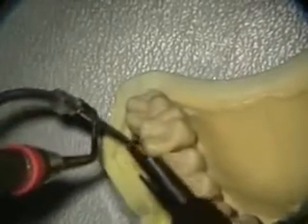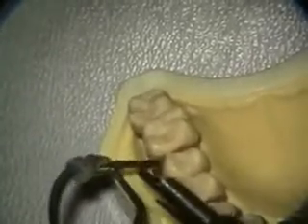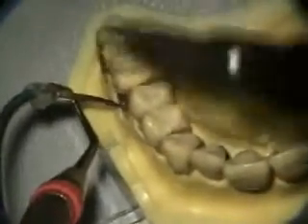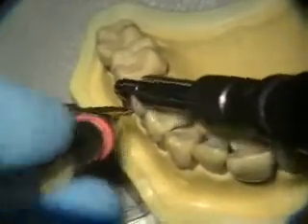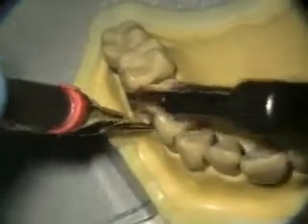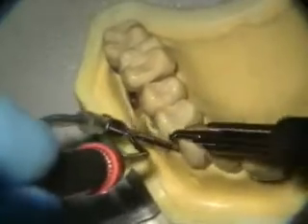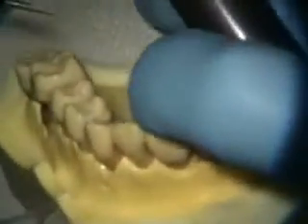So I go here, I go to the distal buccal, clean around, into the furcation, look into the furcation. Sometimes you really have to wiggle these things around to get a good view of things. A lot of times there's not pocketing there, but I'll just scoot by there and concentrate on the mesial. Then go to the distal here. Sometimes there is pocketing here, really deep pocketing, so you're just looking all around. A lot of times the patient will be at about this angle.